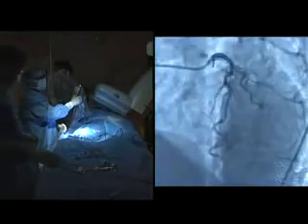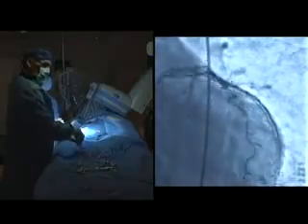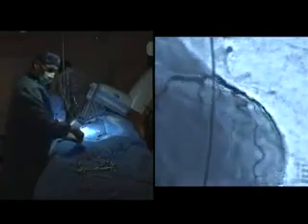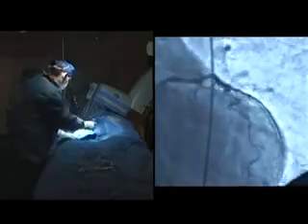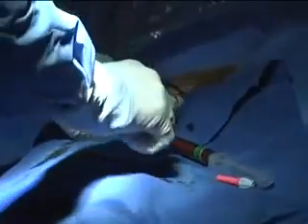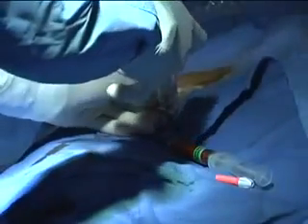We are going to go ahead and open up the right coronary artery. First, we will access the right coronary artery with a special type of catheter called a guiding catheter, place a wire across the blockage, and then pass a catheter that will remove clot from the vessel. In patients with acute coronary syndromes or acute heart attacks, the blockage is from clot and plaque. To make the artery ready for the stent, we need to withdraw some of the clot.